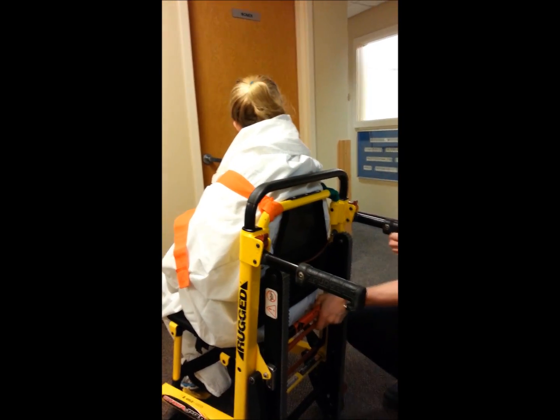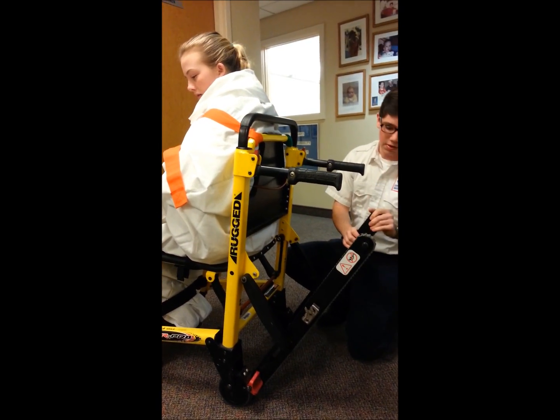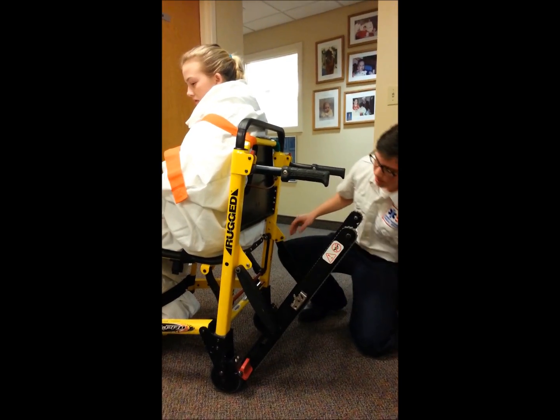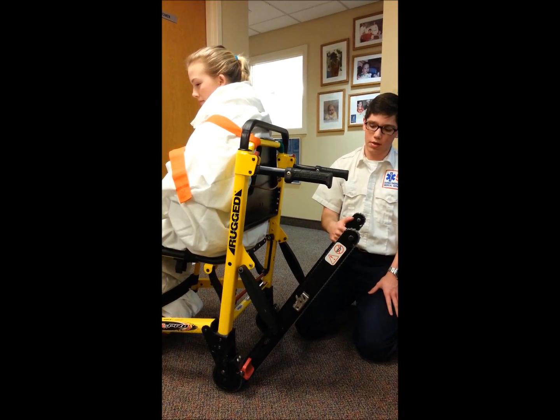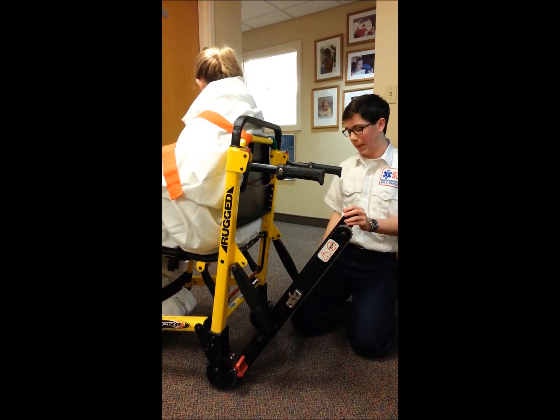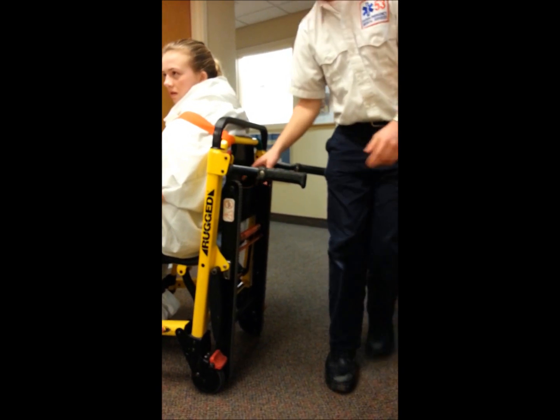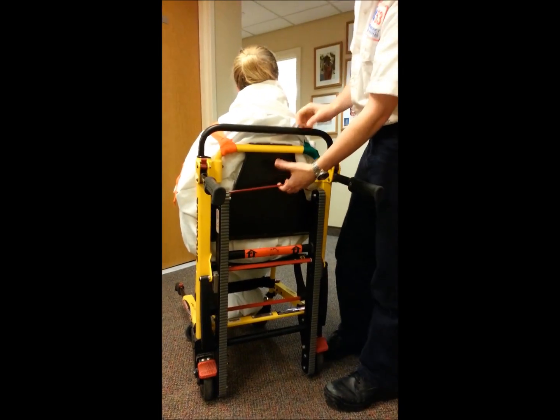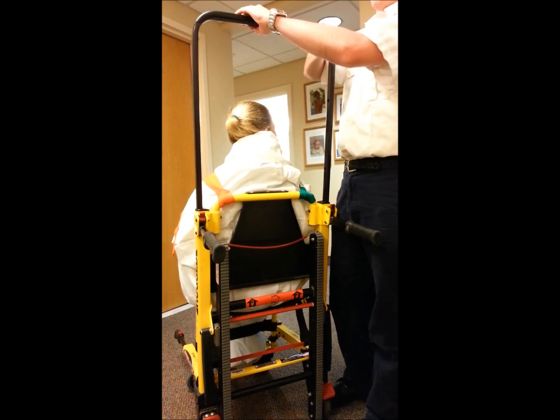Back here are the treads. If you pull this little bar up right here and squeeze like that, these will drop down and catch on the stairs — that's what provides a lot of support on the weight. This bar right here is used when you're putting away the stair chair: you pull it up, lift up the seat piece, and it'll pull back in. These are the brakes. And up here, if you pull this in, this pulls up so you can also lift from the top.